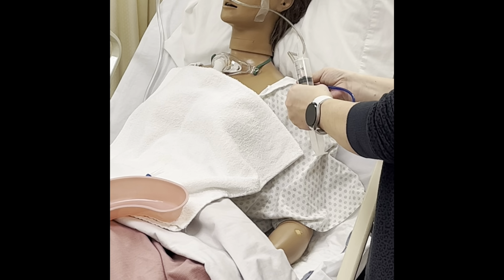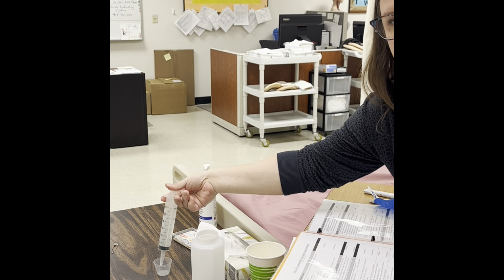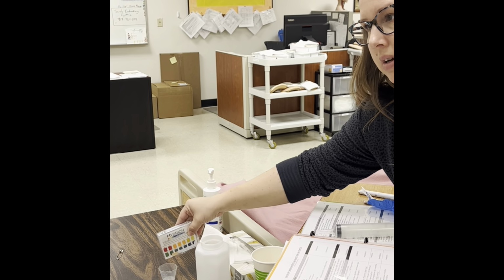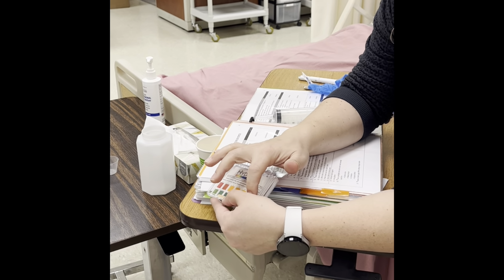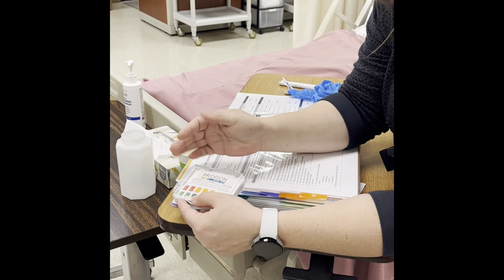So we're going to put this on, and then we're going to take our medicine cup and we would put it in there. Then we would take our pH strip and we want to dip it in there. And acid is going to be 0 to 4, the red to orange. For higher, we're in the small bowel. That's maybe not where they want the tube.